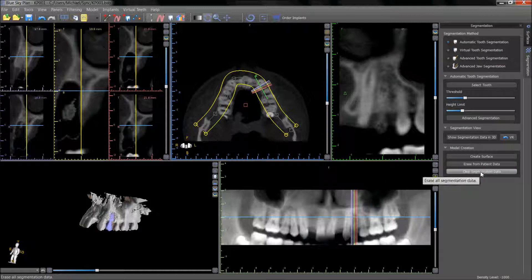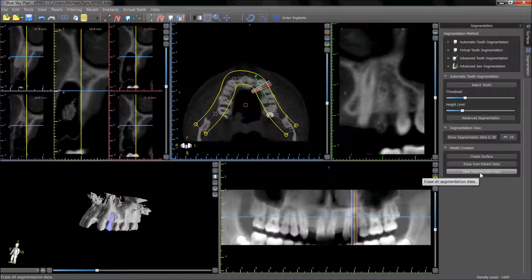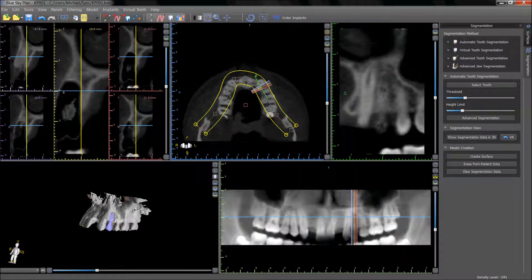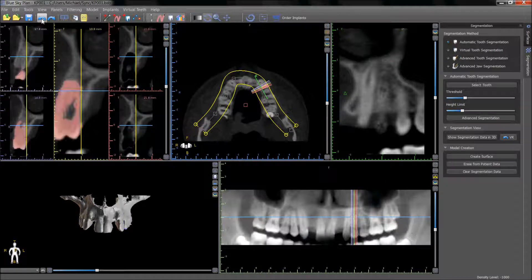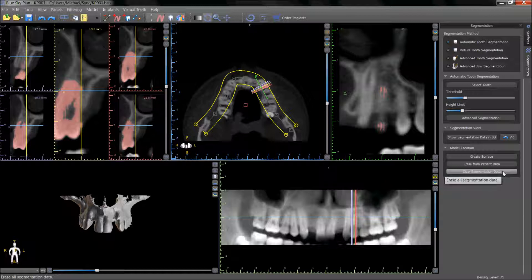Clear segmentation data can be used if the tooth has been selected and you do not want to proceed with creating a surface or erasing from patient data. The clear segmentation data will remove the selected and highlighted area. The undo button can be used to undo the segmentation. Clear segmentation data will also remove the highlighted area in the 2D views.